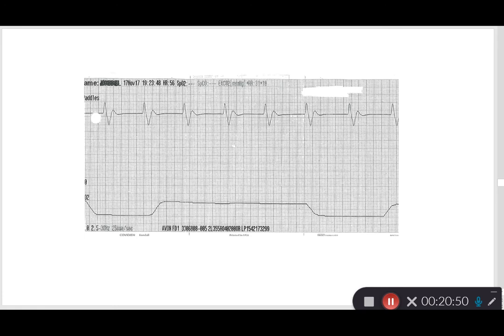All right, looking here, this patient is actually coded, I believe. I can tell because they're reading it through the pads. There's no pulse ox, which is another good indicator. But we're going to pretend this patient does have a pulse. And obviously they are being ventilated because they do have an end tidal, so they're probably being worked. But we're going to pretend they have a pulse at 56, so they're 56 beats per minute.